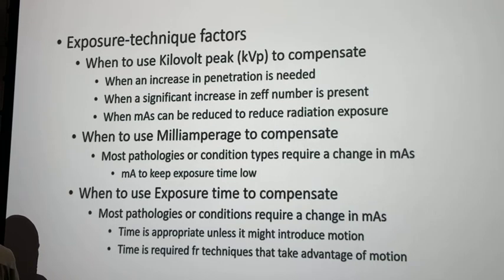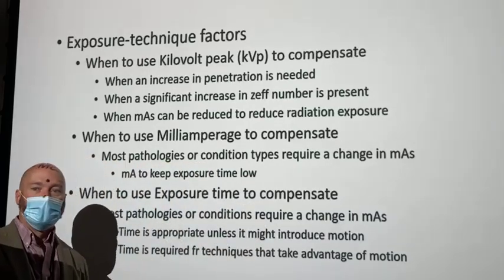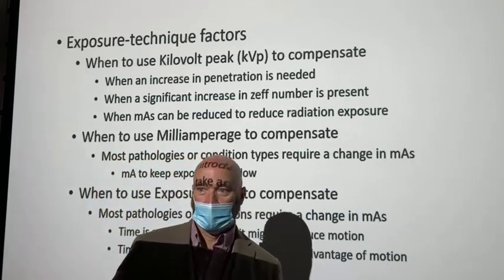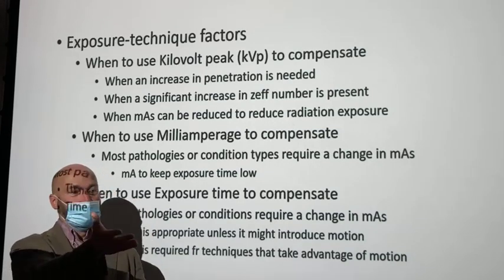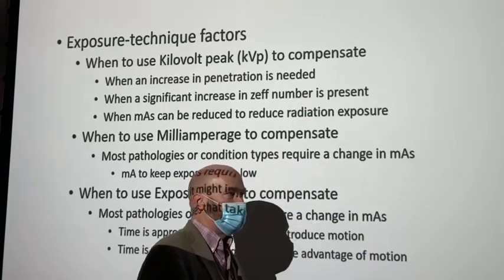For whatever reason, the patient can't come down to the department, but you need to get a lateral T-spine. What do you want with a lateral T-spine? What's your technique? What do you use? I don't mean specifically, in general, for a lateral T-spine to eliminate some of the rib markings and lung markings, what do you use? Okay, 80 kVp and what? Somebody, did you say long time? Long exposure time, somebody? Okay. So long exposure, yes, long exposure time, so that you can utilize the breathing technique, patients breathing in and out throughout the exposure.